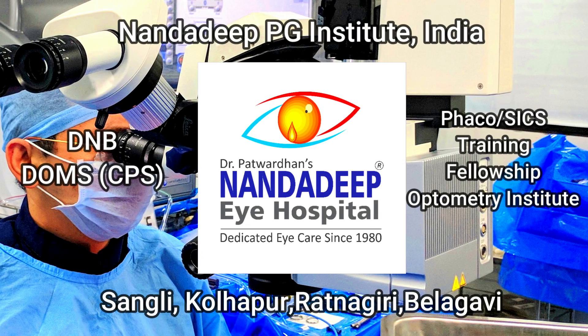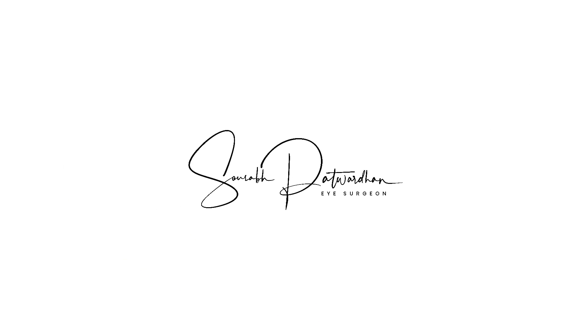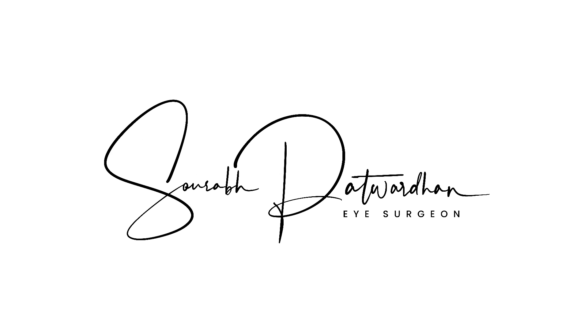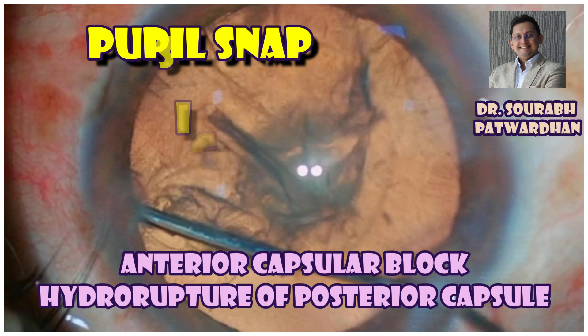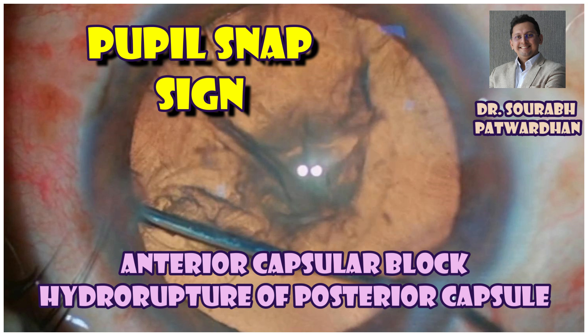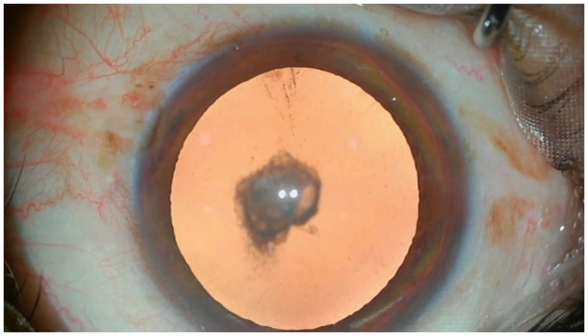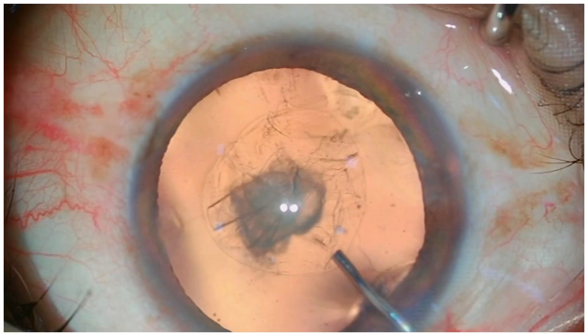In this video, I will be demonstrating a very famous sign described by Dr. Yo. It is called Pupil Snap Sign, which indicates anterior capsular block and hydro rupture of the posterior capsule.